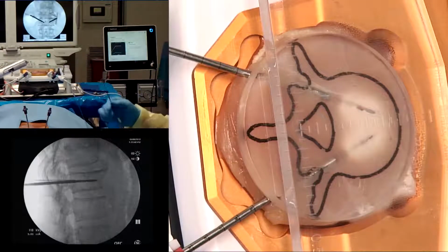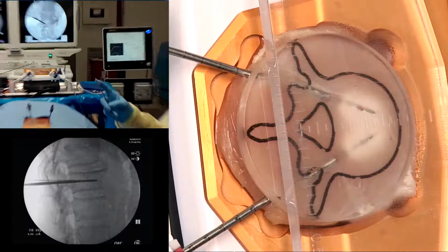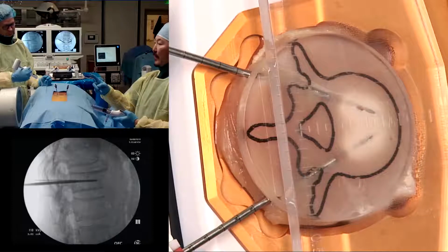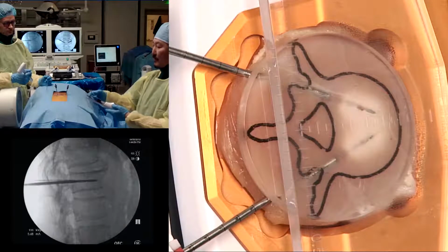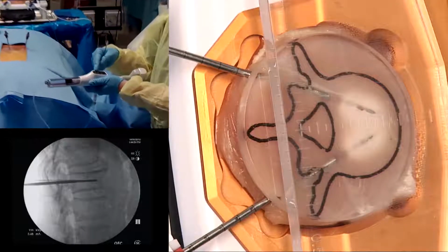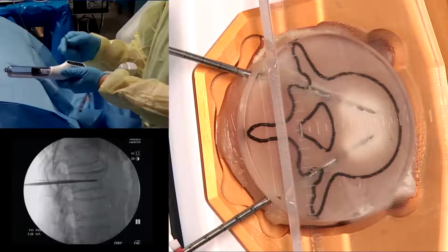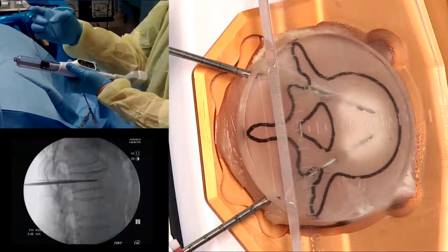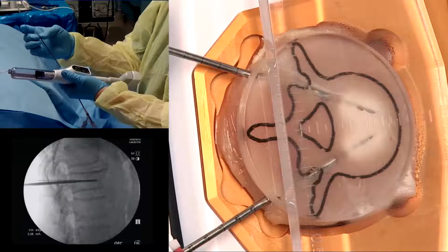And this is no different from a balloon tamp that you'd find for angioplasties. Essentially, it's hooked up to this device, which gives us both volume in cc's as well as pressure in psi's. And within the balloon itself, there are two radiographic markers, one in the distal part of the balloon, and one in the proximal part of the balloon.